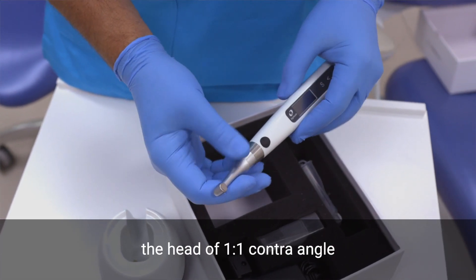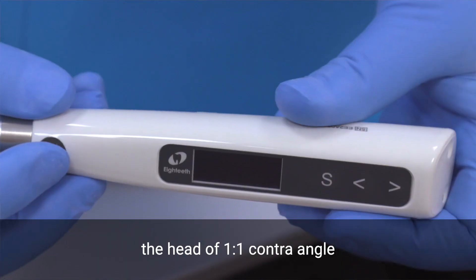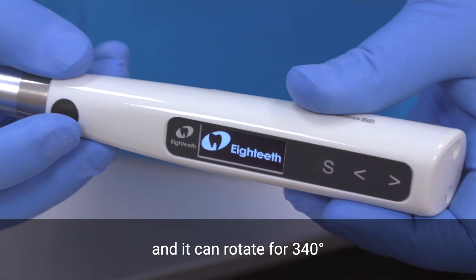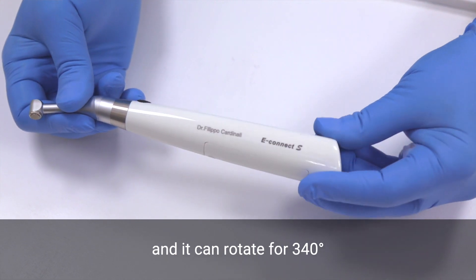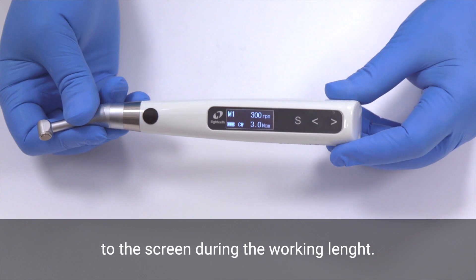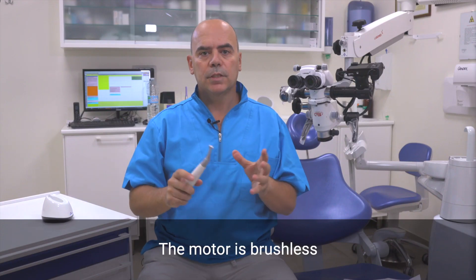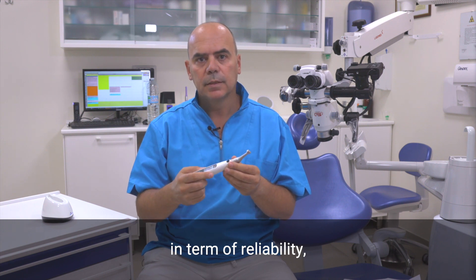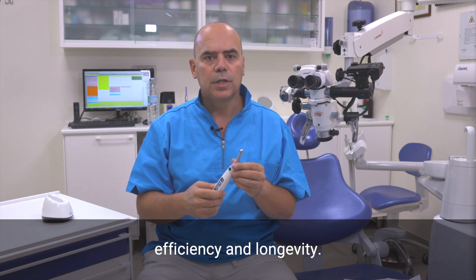Starting from the top, the head of the one-to-one contra angle is a one-piece body design and it can rotate for 340 degrees, allowing the clinician to get a straight view to the screen during the working length. The motor is brushless and this is really important in terms of reliability, efficiency and longevity.